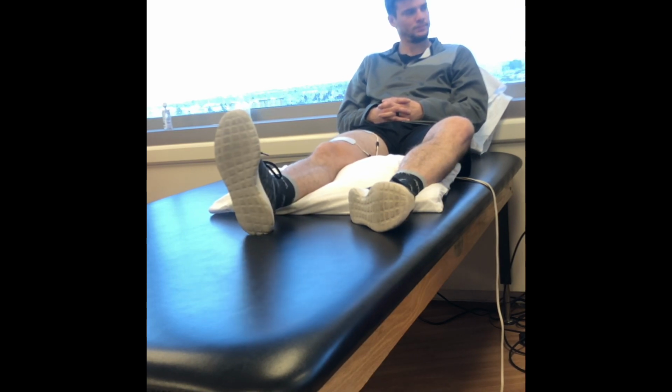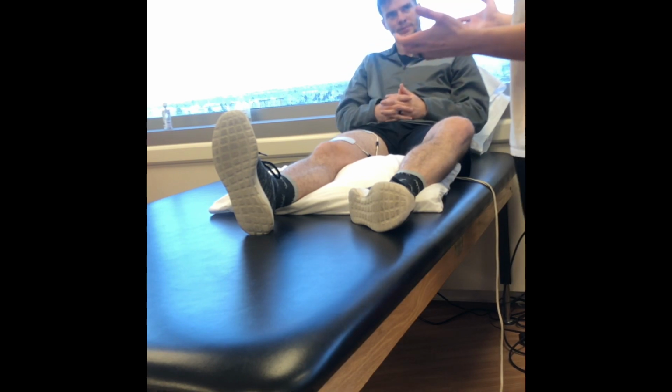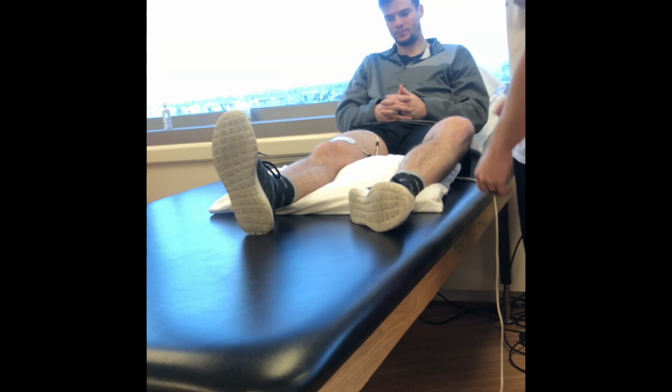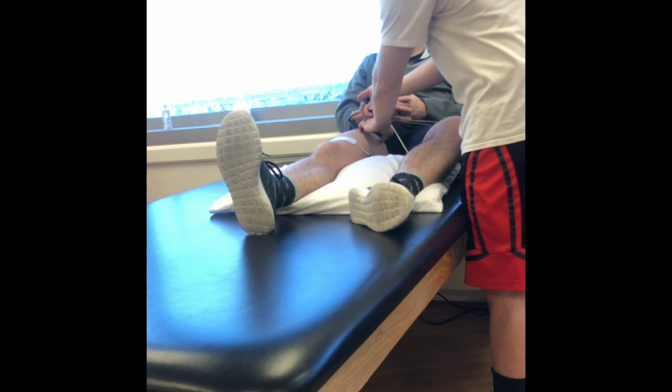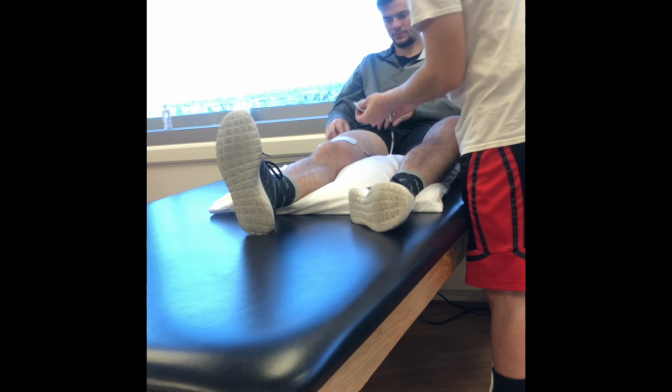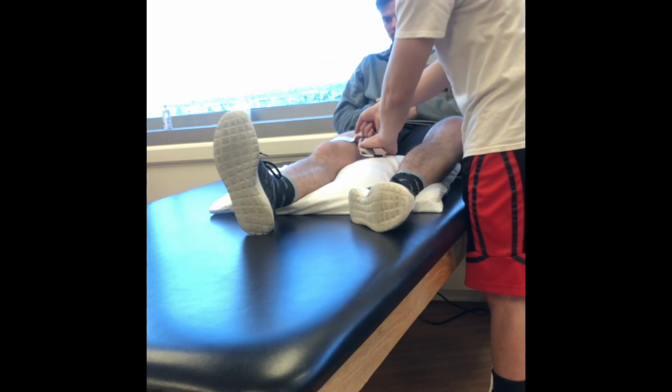Okay, perfect. So I'm going to go ahead and stop here. I'm going to turn off the machine just to make sure that we're not going to get any surprise zaps here. And I'm going to pull this off. This can be kind of painful if the patient has hairy legs. So you want to go from top to bottom as much as you can.